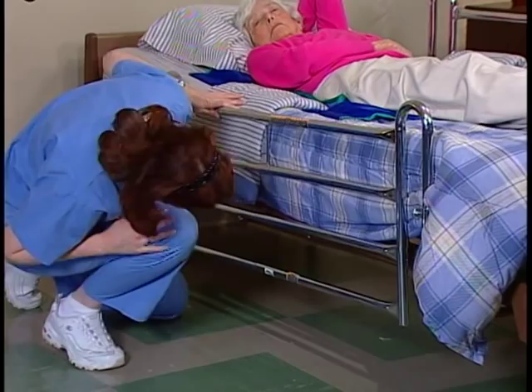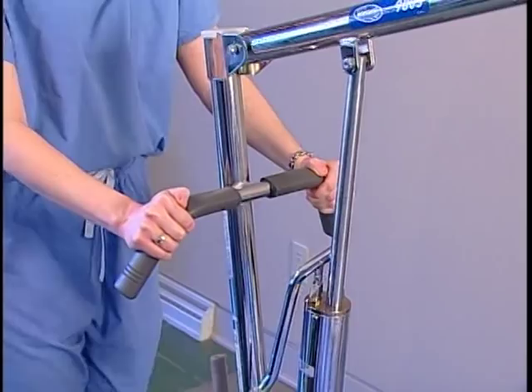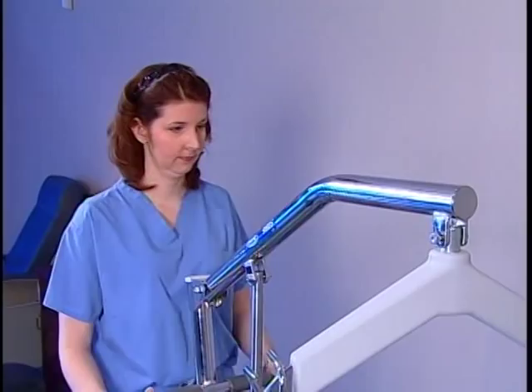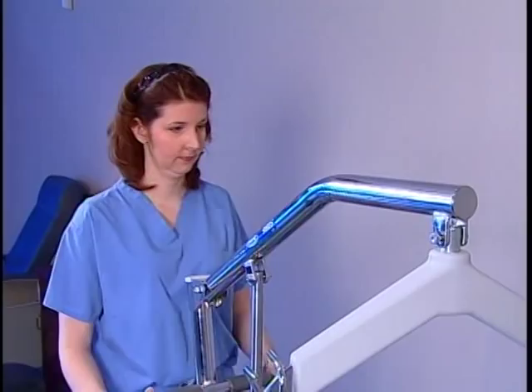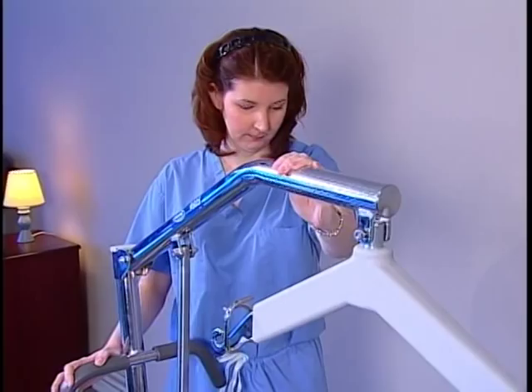Steer the lift with the push handle and move it into position over the bed. Turn the control valve on the hydraulic pump counterclockwise to lower the boom. Lower it close enough to the resident so that you can attach the sling to the swivel bar. The swivel bar should be aligned so that it's parallel with the resident's shoulders for proper attachment. Keep the swivel bar away from the resident's head.